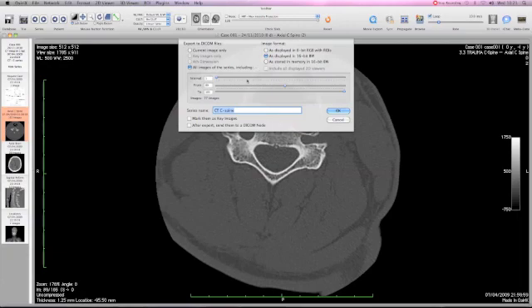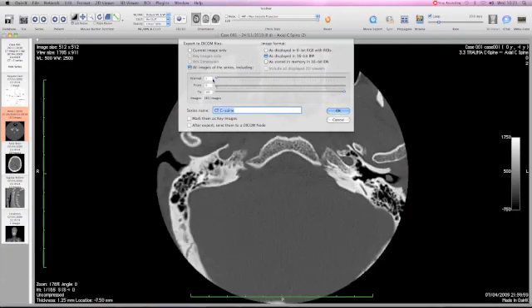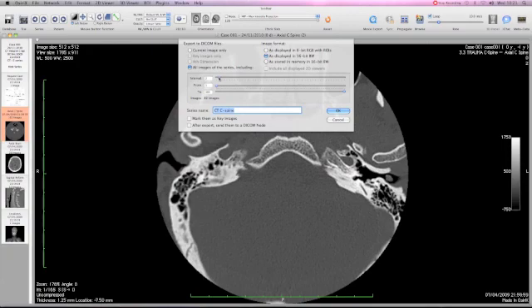When we move down, we can see that we can vary the interval. So at the moment, it's set to one, which means that effectively every image would be included if we saved it. If we shift this to the right, we can see that if it's interval of two, we would save alternate images. And then the number of images also reduces on the bottom. At the moment here, we're saving every fifth image and there would only be 33 images in the total stack.